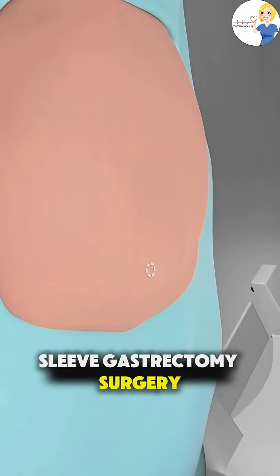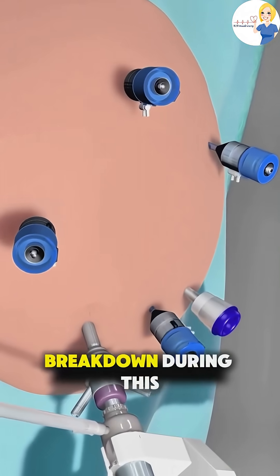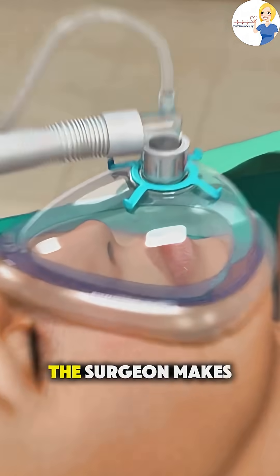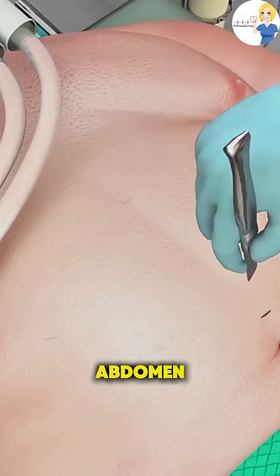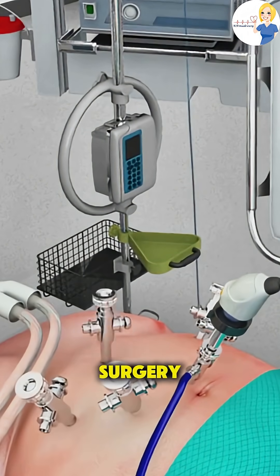Ever wonder how sleeve gastrectomy surgery actually works to help with weight loss? Here's a quick breakdown. During this procedure, done under general anesthesia, the surgeon makes a few small incisions in your abdomen and uses a laparoscope — a tiny camera — to guide the surgery.